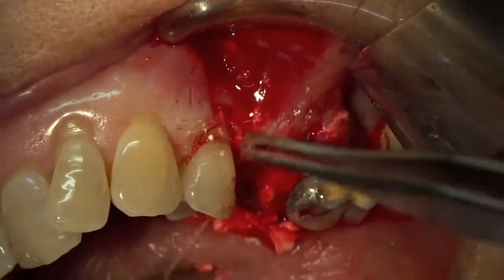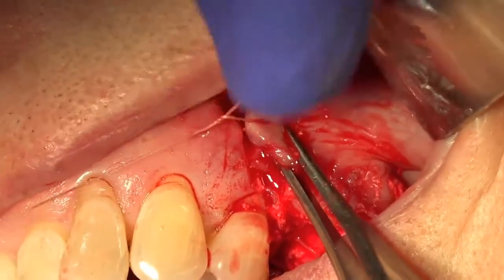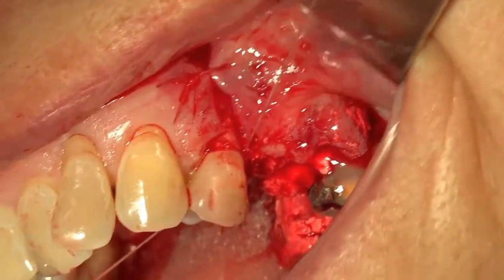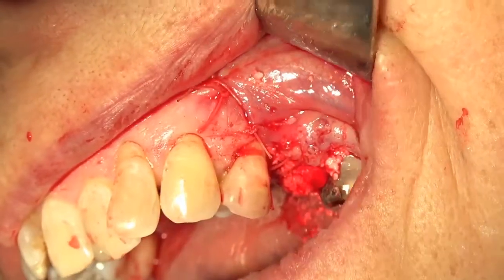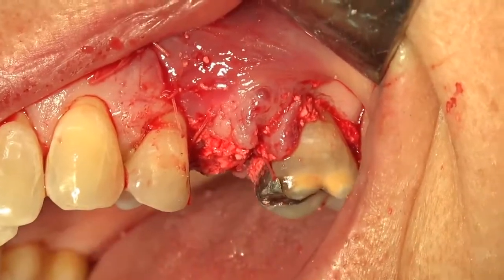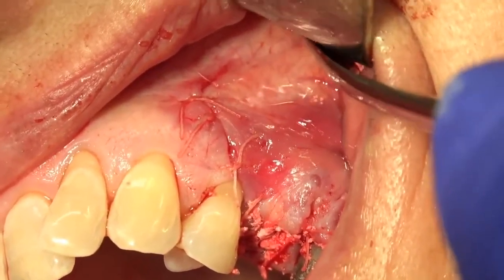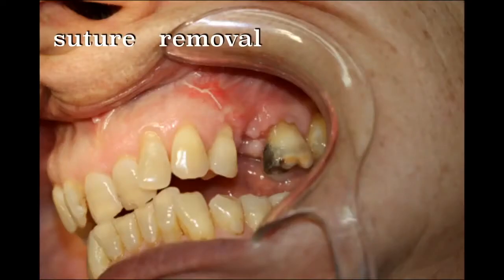We don't do any dissection. We don't want to have a tension-free primary closure. We want to have the flap with tension, not tension-free. In that way, it is less invasive to the patient and it is not connected to the muscle. So during the healing period, there is absolutely no movement of the flap above the graft. Do not use any membrane or PRF above the graft. It must be in direct contact with the periosteum. Now, as you see, if we move the vestibule, there is absolutely no movement of the suture, which shows us that we are going to have a good success due to the stability of the graft.